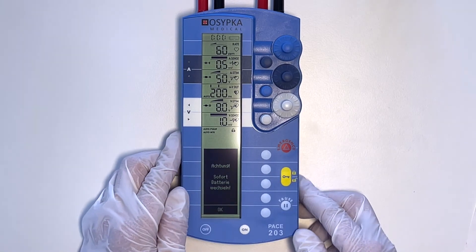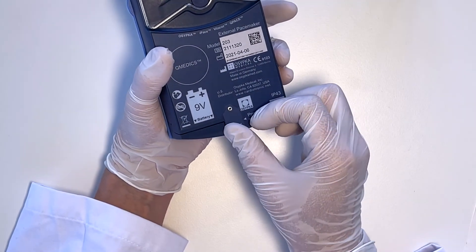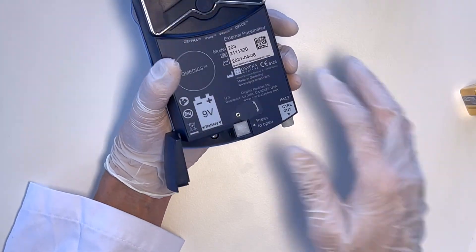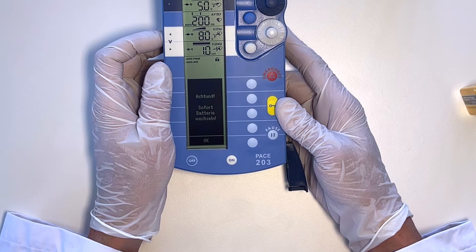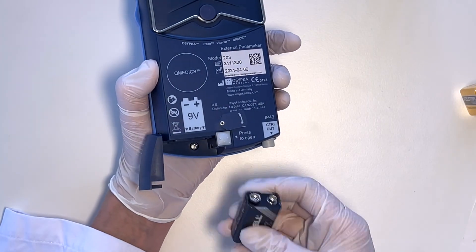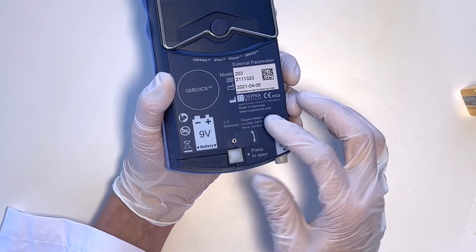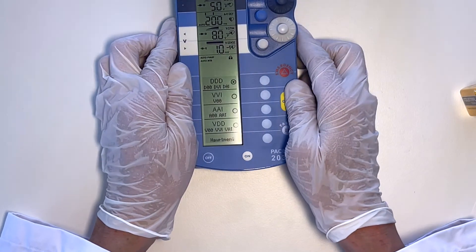Changing the battery is very simple. You do NOT disconnect from the patient. Simply turn the device over — there is a small flap. Move it to the side, press the button, and the battery tips out into your hand. If you put the device down, you can see that it is still pacing and giving you the message CHANGE THE BATTERY. Take a new 9V battery — it can go in either way, as long as the connection poles go in first. Pop it in, close the flap. There are no more buttons to press. The PACE 203 will carry on stimulating without a pause, exactly as you left it.